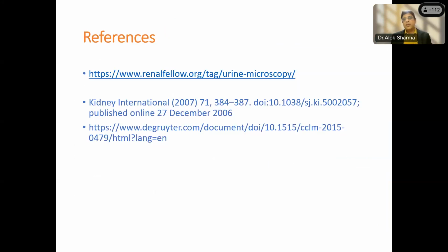So this is how it is. We've covered most of the parts here, and I'll just stop for a second if you want to note down or take a screenshot. These are a few good references which you can note down and do a more detailed, comprehensive study.